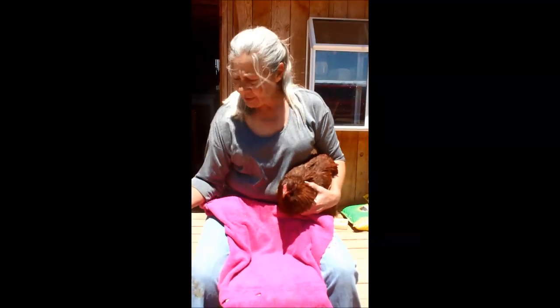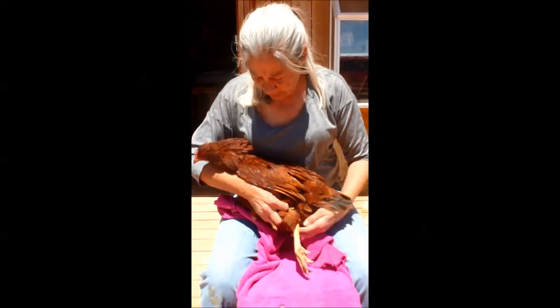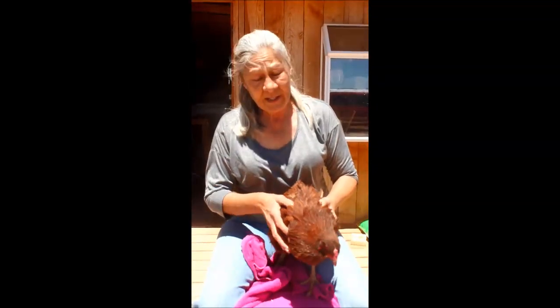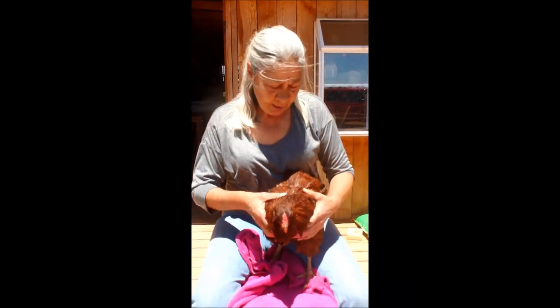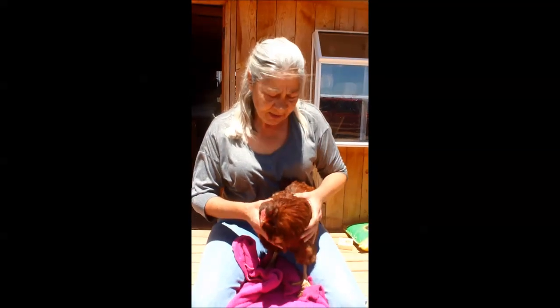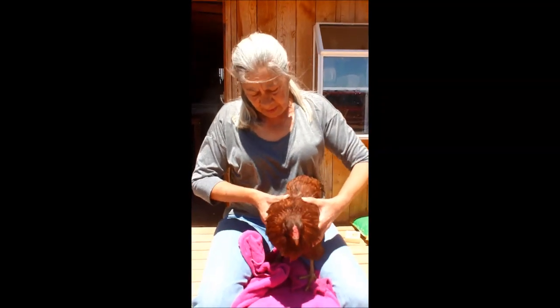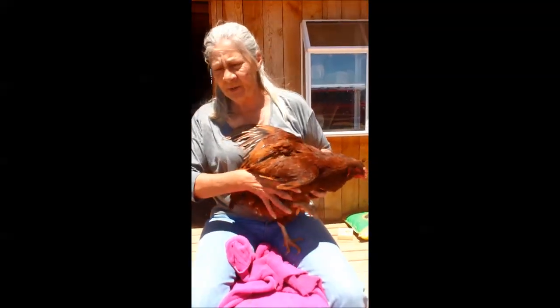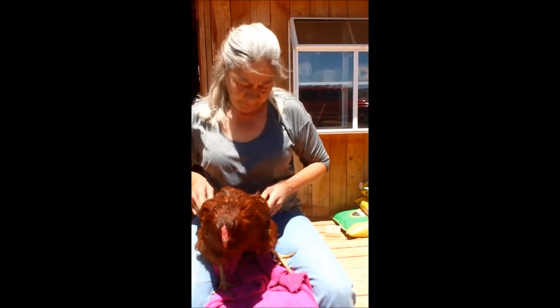When you're injecting, you want to go very close to the cloaca. You want to make sure that you're working on her right side, because all of her major organs would be on her left side. Her heart and her oviduct, I guess you would call it, is on her left side. So once you get her in position, make sure you're working on her right side. And you want to get as low as you can for drainage in case you have to drain her over a cup. Come on, you'll be fine. You'll be fine.